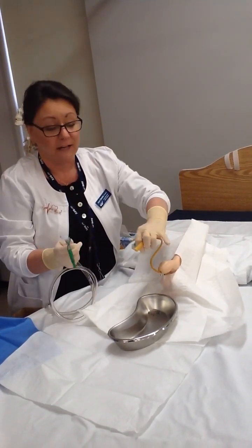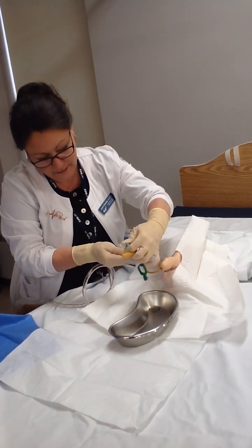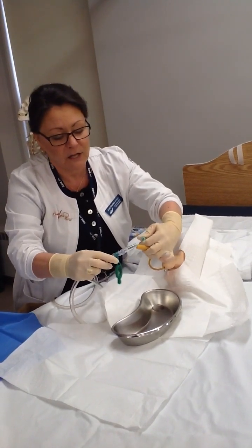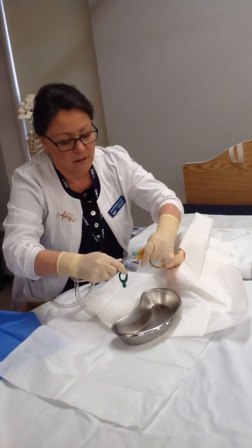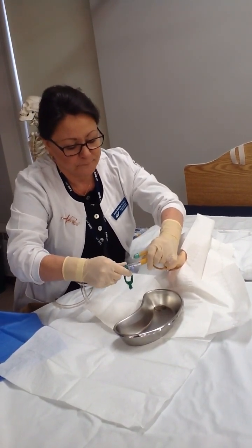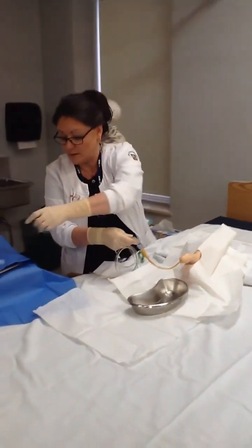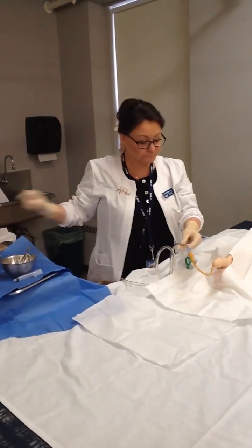I'm going to reach my tubing under my hand to grab the cap off it with my pinky, come up and marry those two ends together. Get that on nice and snug. Move that out of the way.